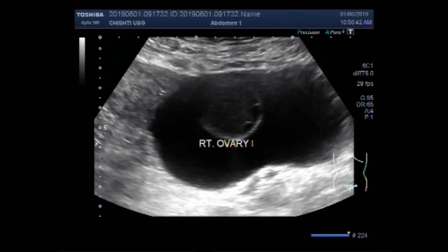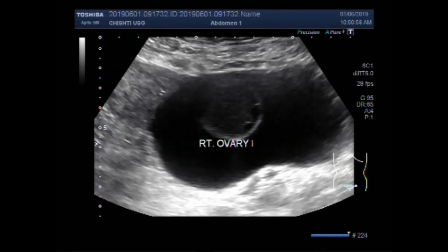This is the right ovarian cyst, a simple cyst. The cyst is strong in ovarian shape and has a clear fluid inside it. No septa are visible, no turbidity is seen inside the cyst.